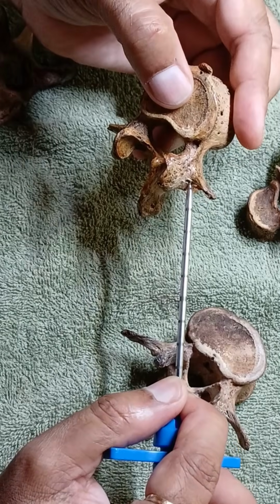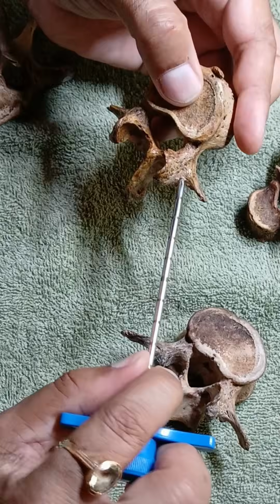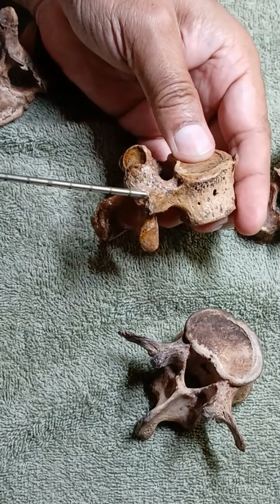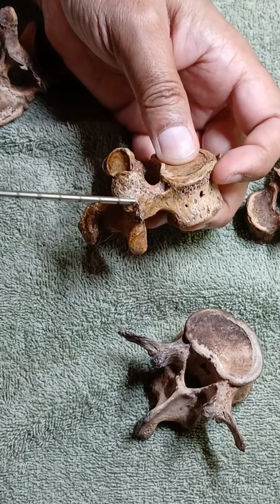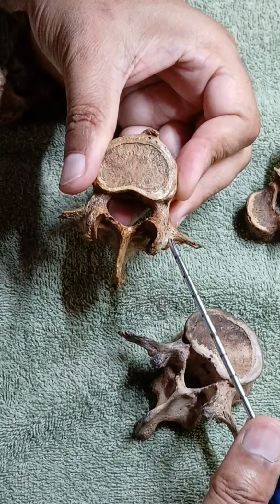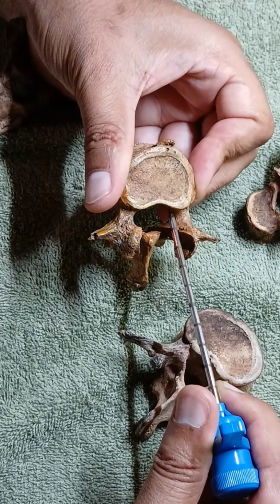So you have to adjust the needle in such a way that your trajectory is towards the fractured part of the vertebra in between the end plates, as well as medially until it crosses the medial border of the pedicle. This you have to see.